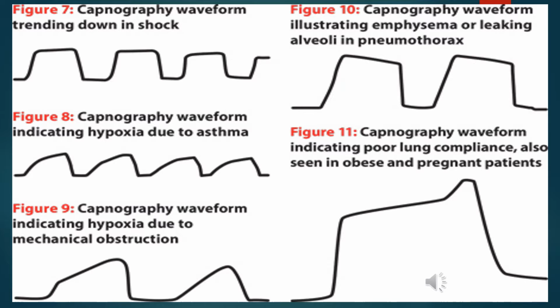You also see it doesn't go down to baseline there at the end on the inhalation phase. After phase 3, it's above baseline. So that also indicates poor lung compliance, and they're not getting back to baseline on the inhalation phase, and they're pushing out on the exhalation phase on phase 3. So these are very intricate, minute differences that you can see on waveforms. If you study these, you can get really good at diagnosing a patient based on just the simple exhalation that the patient's doing.